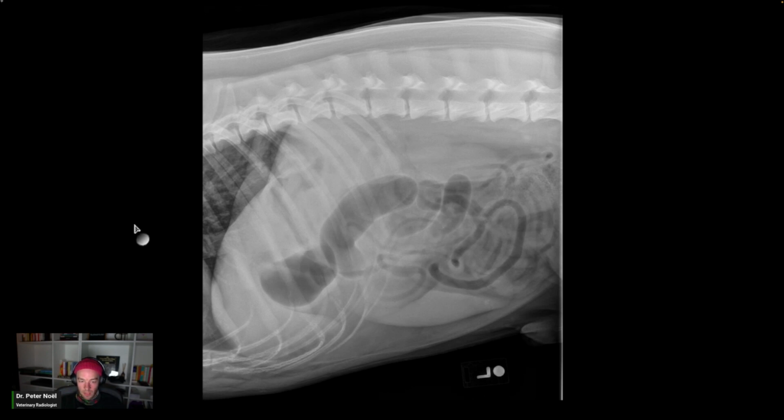Great example of how on the left lateral view, the gas should distribute at least to the fundus, to the pylorus. Not always, but it should. And on the right lateral view, it usually doesn't. The gastric axis we describe as an indirect inference to the adequate or objective size of the liver. So we'd like it to be parallel to a rib or perpendicular to the vertebral column.